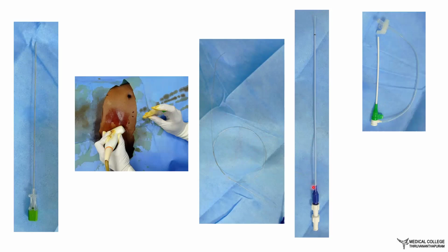What we have changed in our institute is that we are doing the entire procedure with this sheath in situ. This sheath will allow a 4 French catheter to go through. We have a SIM, Cobra, everything is available for 4 French, which will go through this and suffice as well. Generally, nowadays, we do not rely much on using the sheath per se.